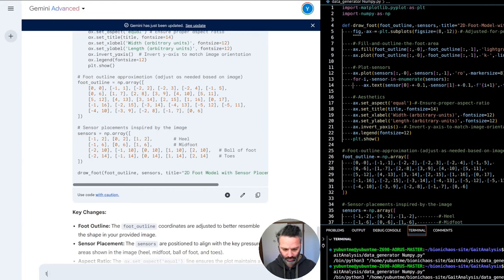Customization: feel free to further refine the foot_outline and sensors arrays. This is the result. What do you think about it?